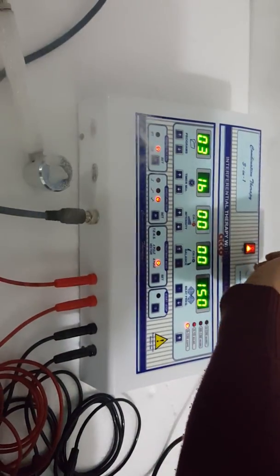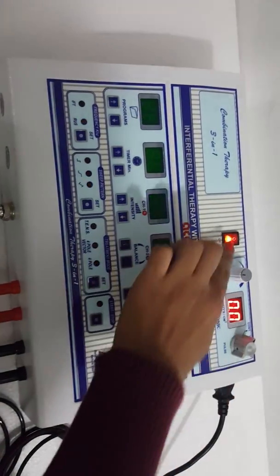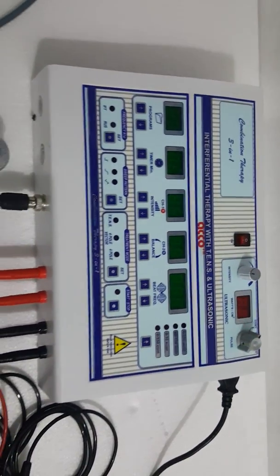After treatment is completed, make the density knob at 0. Switch off the machine. The demo is completed, thank you.